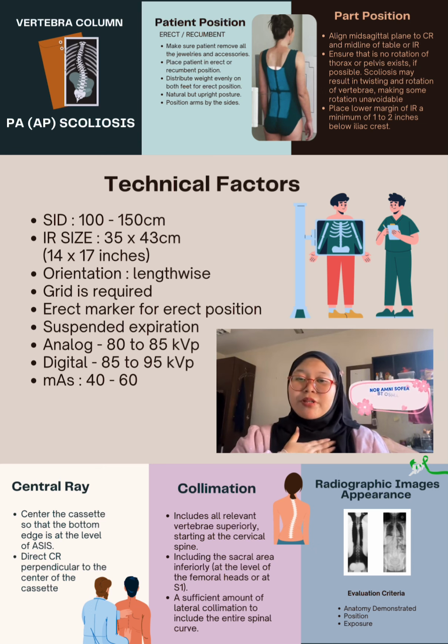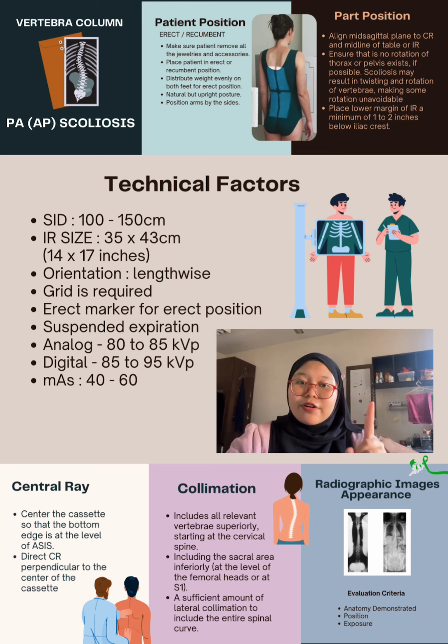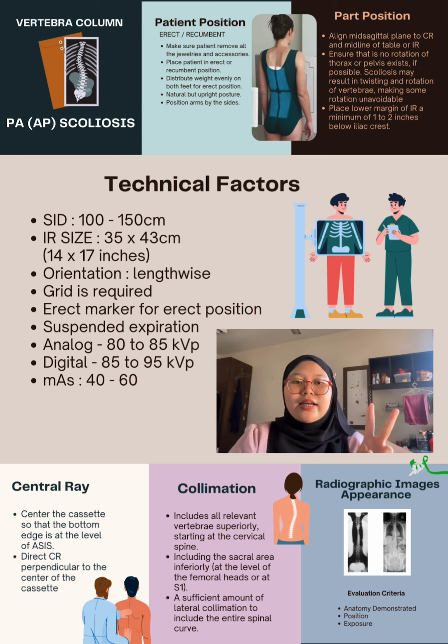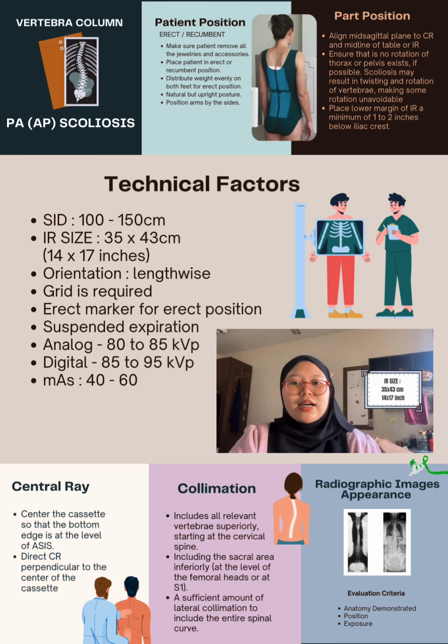My name is SOFEA binti OSMAN and I will start the presentation video with the technical factors that need to be considered in this projection. The first thing is the SID. SID is between 100 cm to 150 cm. The second is the size of image receptor. The size is 35 times 43 cm or 14 times 17 inch.